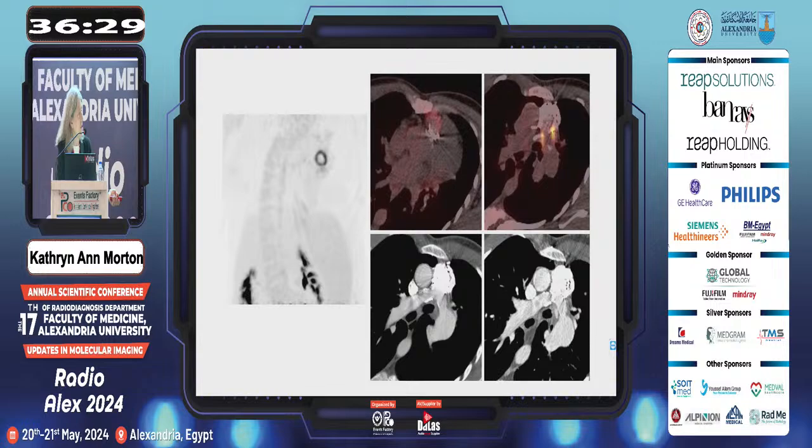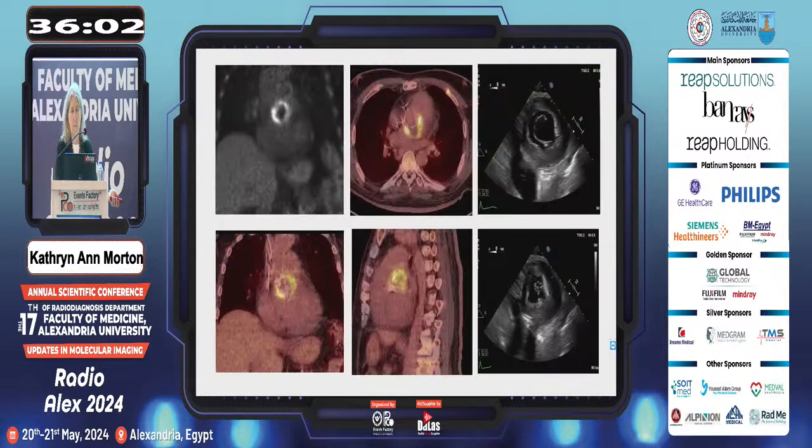I think it's interesting if you look at these two CT scans. This is an earlier CT in which you see the nice, well-defined margins of the outflow graft, but notice here, which corresponded to the same interval, you can see that there are little out pouches. I don't know if you can see those well, little out pouches, so pseudoaneurysms of the conduit, the pulmonary conduit.